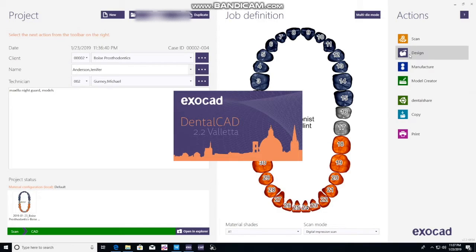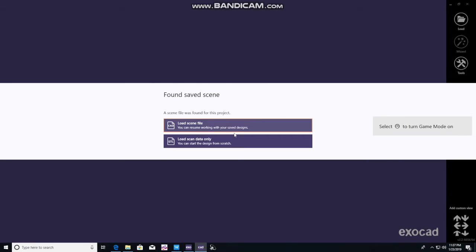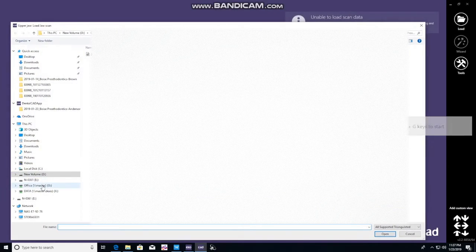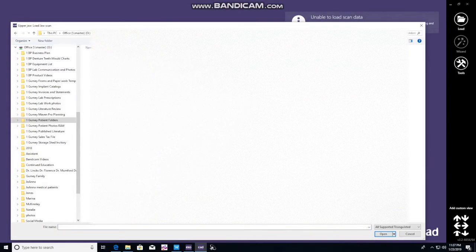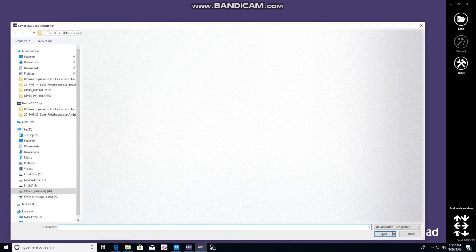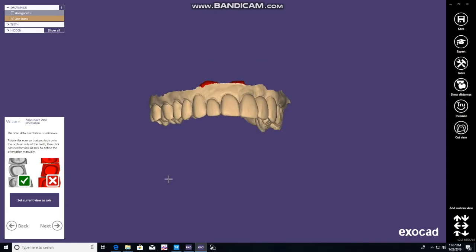Design will take you to a window asking where you'll get the data from. In this case we're going to use raw original data — load scan data. Then it'll take us to the network. We go to the O drive, find the patient folder, and find the scan that we need to load. Click on it and you'll follow the prompts for the upper and then the lower. That was prompted up in the left-hand corner of that window.